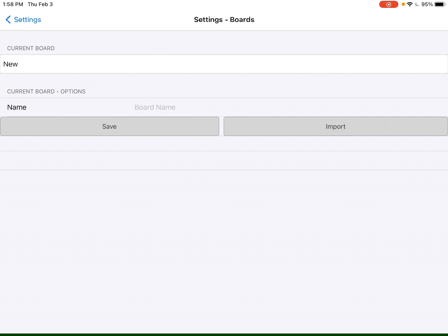As we've added features to this, I've kept the cost down because I think it's super important for families and for teachers, not only speech paths, but parents and teachers to have a really easy way for their kids to communicate and something that's affordable. For example, the Amazon Fire tablets are so cheap, especially certain times of the year. So that makes it a very easy way to purchase and have a communication system for your child.